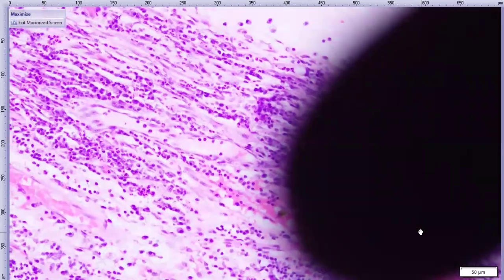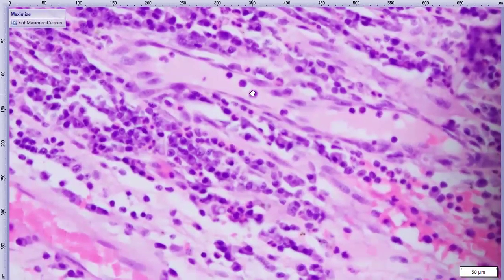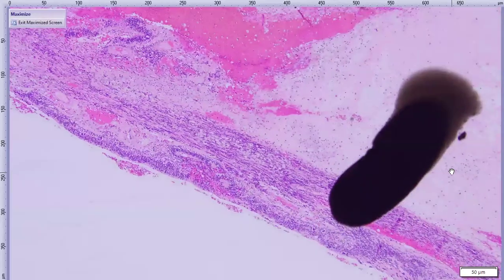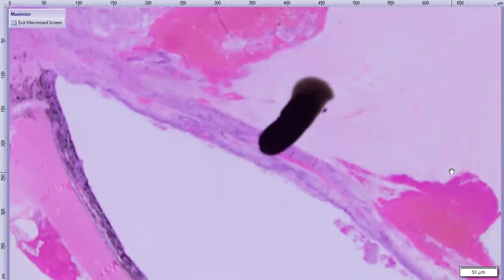As we look around, maybe around this very helpful dot that I've made, get good resolution. There's another cell type in here. A little hard to make out on this screen at least, but there's these guys that have these bilobed nuclei. There's more of them, and they have brightly eosinophilic cytoplasmic granules. So these are eosinophils, just floating around in this membrane, which is weird. We don't tend to see eosinophils very commonly within the eye. And their reason, at least in this slide, is not evident why they're there.